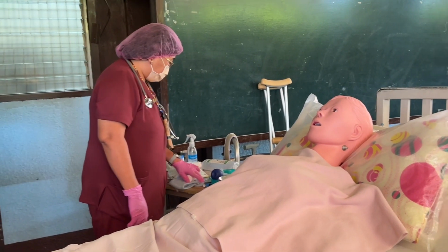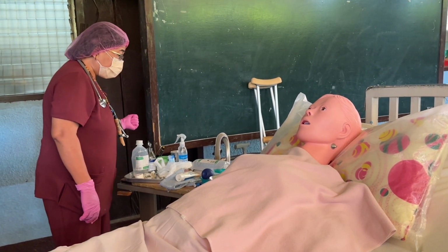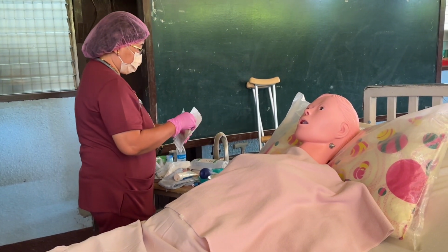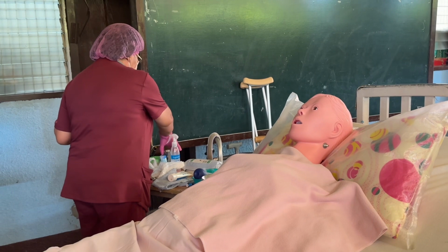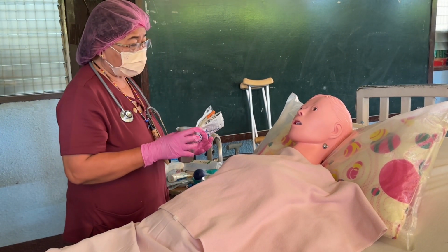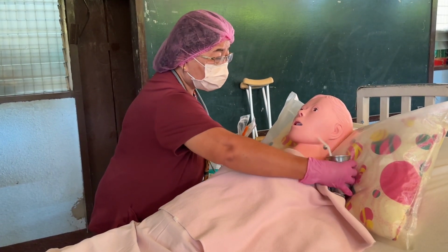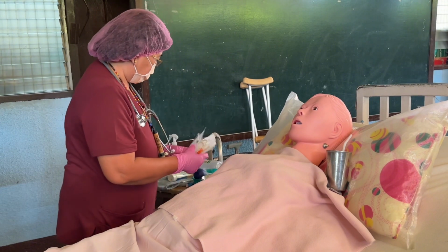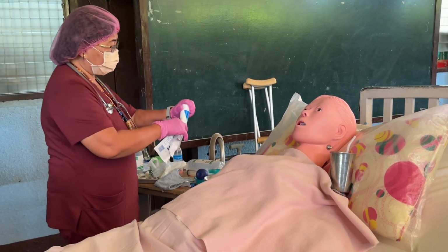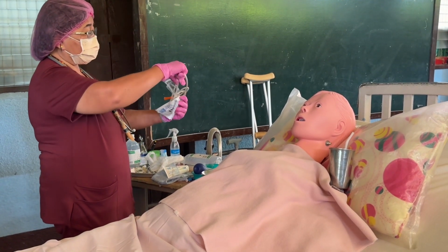Then after that, you're now going to get the tube. The tube. Then, ma'am, can you hold this water, ma'am? When I direct you to sip water, can you sip? Okay, so the patient is holding already the water with a straw. And then I'm now going to get the tube with the white jelly. Okay, I'm going to pull it.